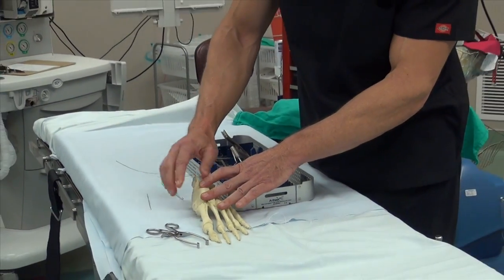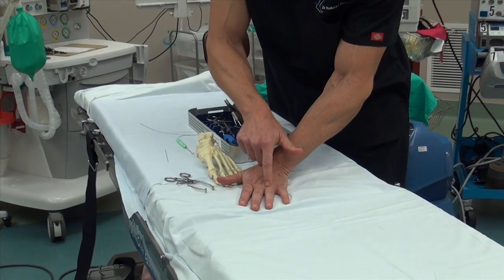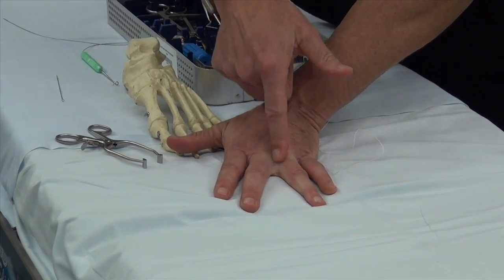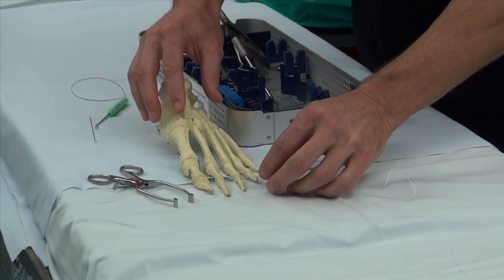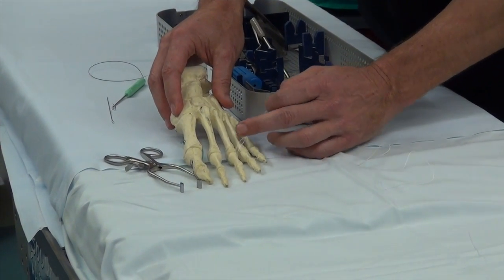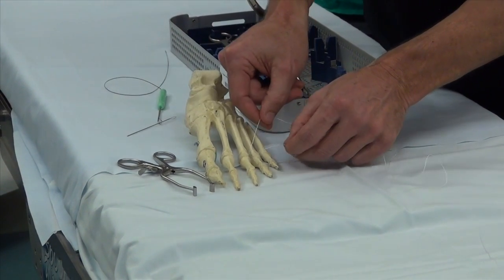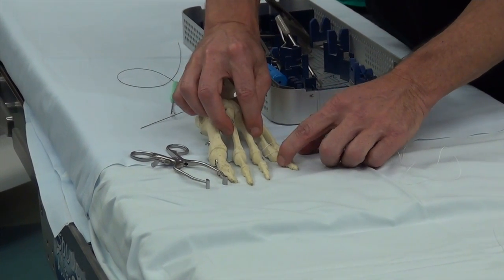The patient you're about to see is unique. Her fourth toe joint was torn sideways in an accident, hitting it against a bed post, and it stayed like that. We make an incision between the third and fourth toes, use the pigtail, pass it through the fourth toe which is splayed outward, then drill a hole in the proximal phalanx and fish it through.